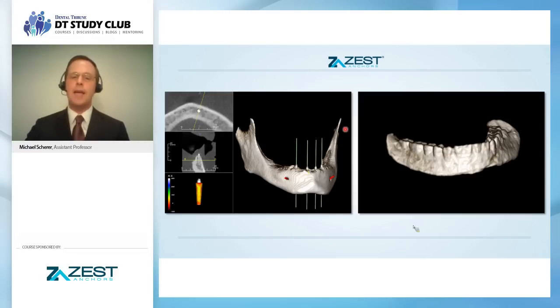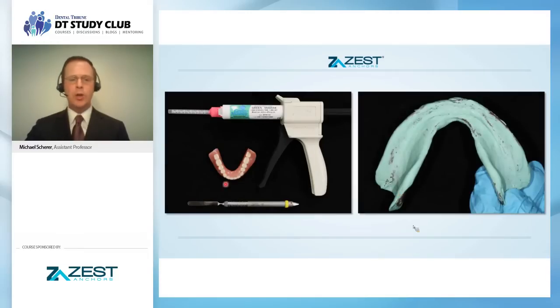Here we've scanned the patient, done an initial plan, and gone ahead and scanned the complete denture. This is what a regular complete denture looks like in a cone beam scan. All I've done is increase the thresholding level, or the brightness, and that will allow you to visualize the complete denture. One trick that I like to use is a radiodense polyvinyl siloxane type material. That just happens to be the green mousse product, which is a cousin of blue mousse.